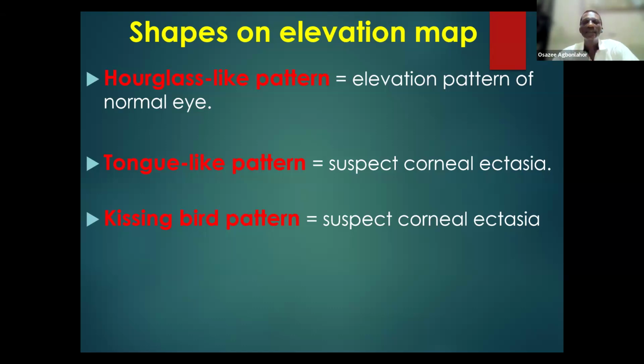So I was trying to tell you that it's really confusing understanding these terms. However, with time, if you keep studying them, especially when you have referred a patient for such a procedure or test, and we see the result, it makes more sense.